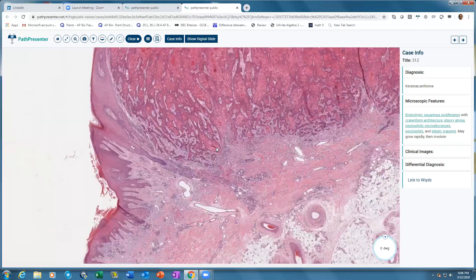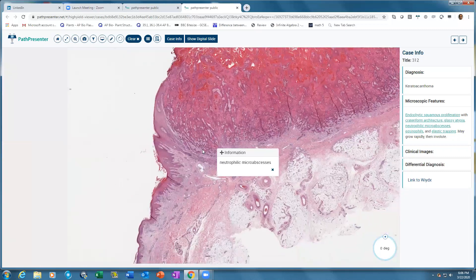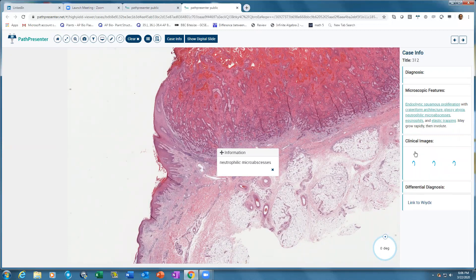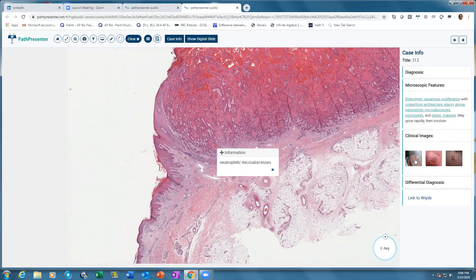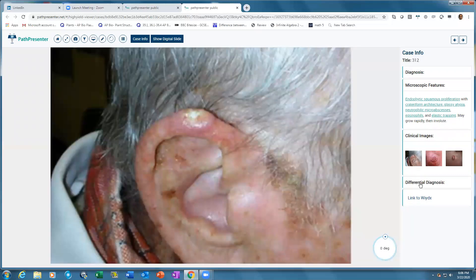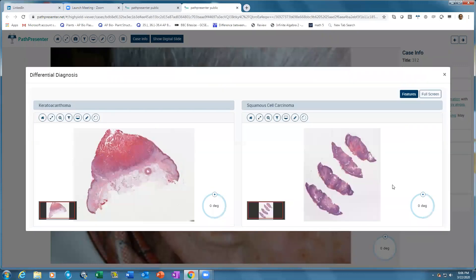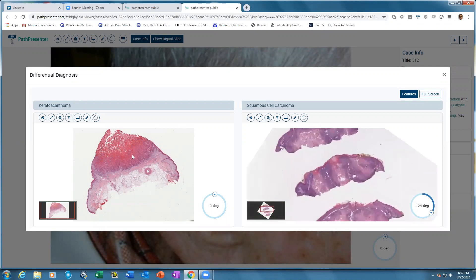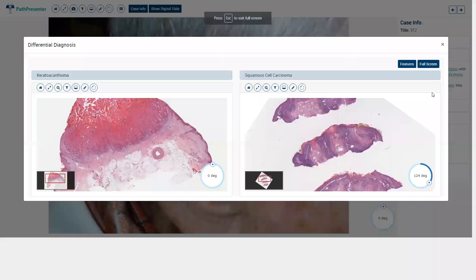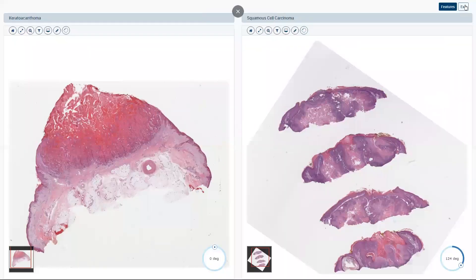You can see it has found the neutrophilic micro-abscess and shown it to you just as you would see on a multi-headed or two-headed scope. There are associated clinical images — click on any of them and they open up. For differential diagnosis, you have slides that open up side by side so you can compare. For example, squamous cell carcinoma in comparison to a keratoacanthoma. There is also a full-screen button to make it full screen, and you can exit out of it.